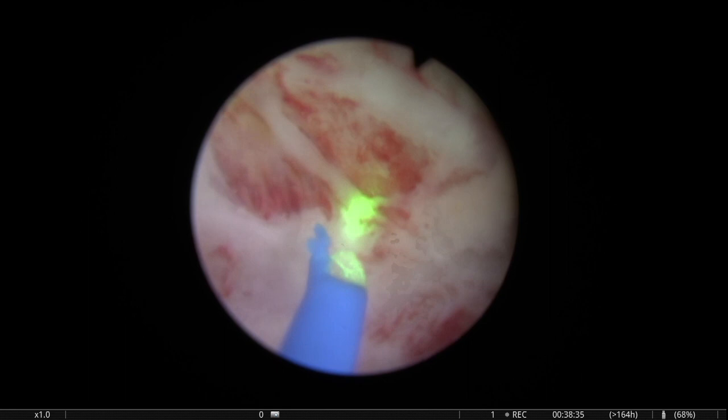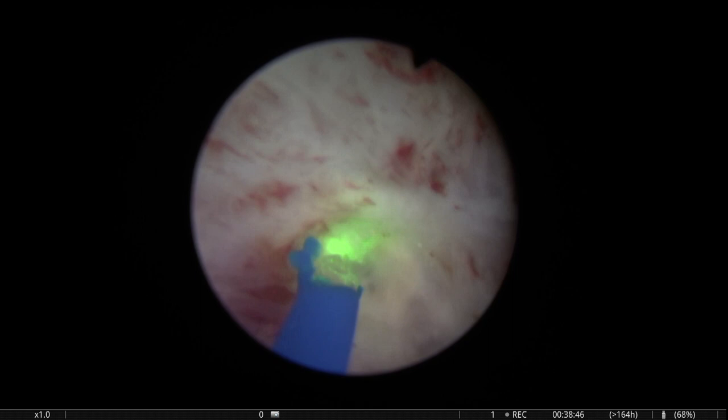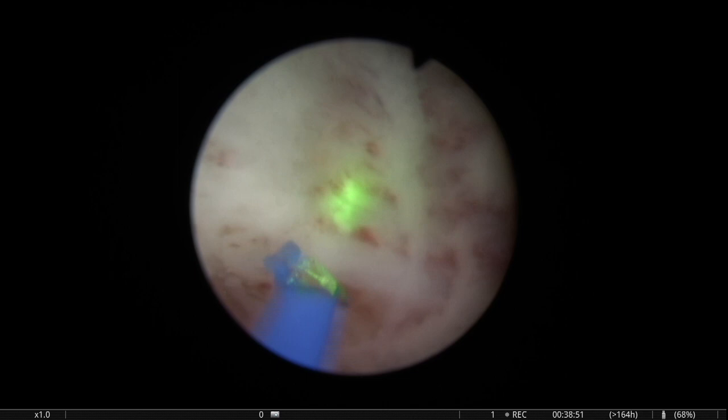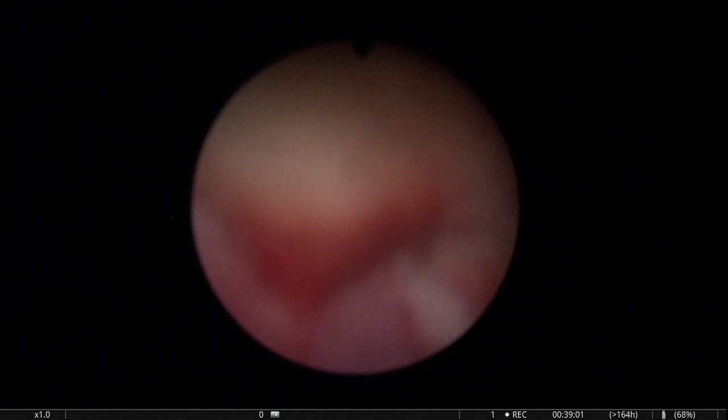Here you see that the fiber is again a little bit degraded at the tip. So if you are doing hemostasis and you find that the hemostasis is not happening properly, then just take the fiber out, cut it with normal scissors. You don't need to have specific scissors to cut the fiber, just cut it with a scissor. And that's the nodule, that's the adenoma ready for morcellation.